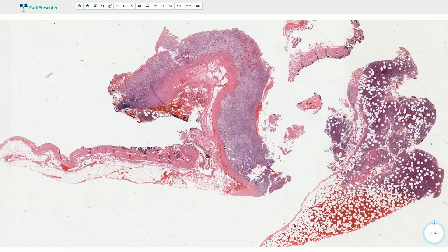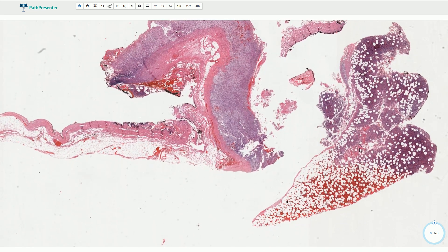Myelolipoma of the adrenal gland is a tumor or tumor-like lesion composed of adipose tissue and hematopoietic elements. It is usually a well-circumscribed lesion, typically without a capsule, and clinically it is usually asymptomatic. It is one type of incidentaloma — lesions in the adrenal glands that are discovered incidentally and are asymptomatic.